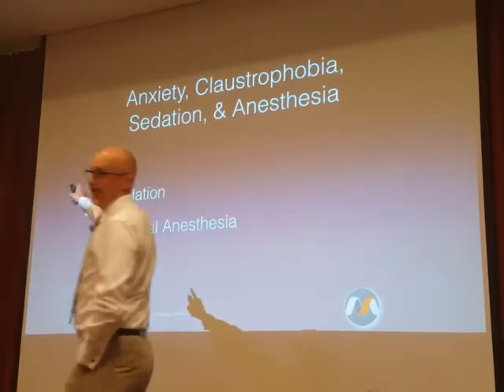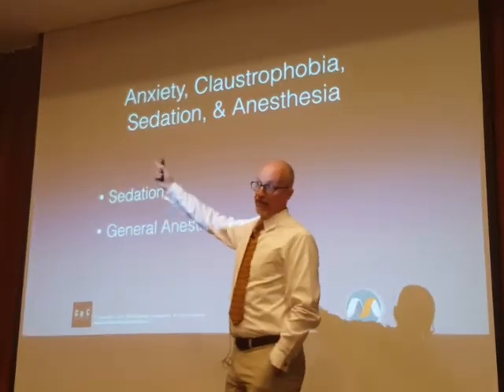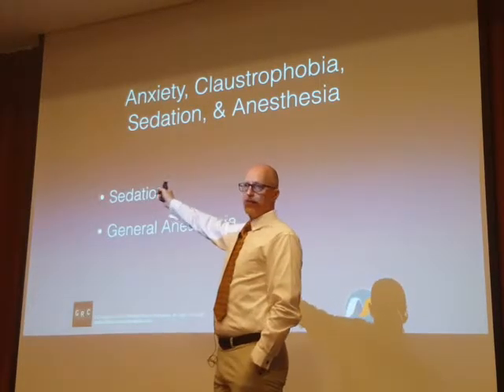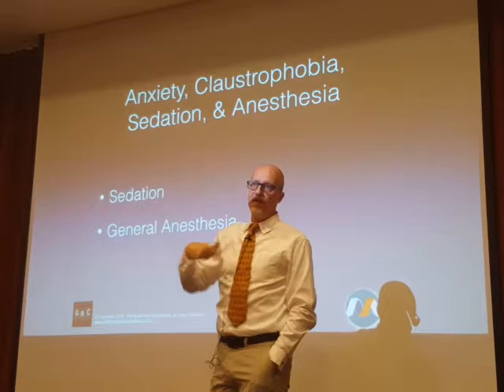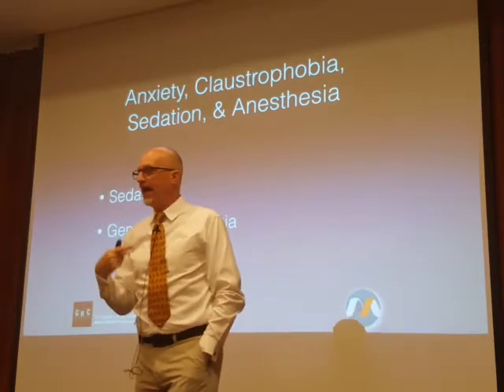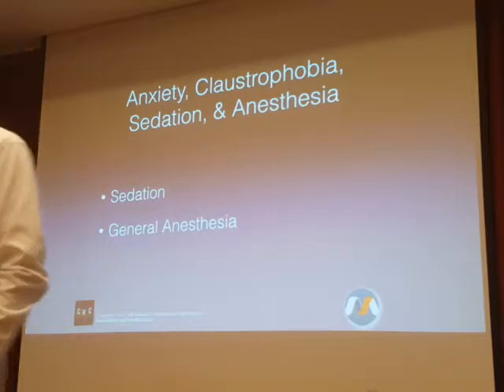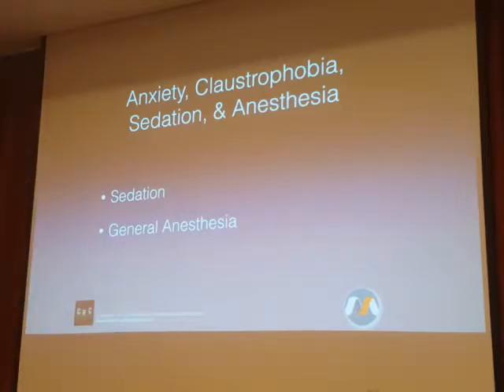Once we start sedating them, or they sedate themselves, and the patient is altered in some way and maybe isn't able to accurately participate in their own screening, or it somehow compromises their ability to be an accurate historian of what medical processes, procedures they've undergone in their life, now that begins to compromise safety.